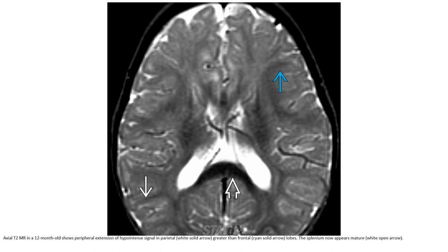T2 image in a 12-month-old shows peripheral extension of hypointense signal in parietal regions, greater than frontal. The splenium now appears fully mature.